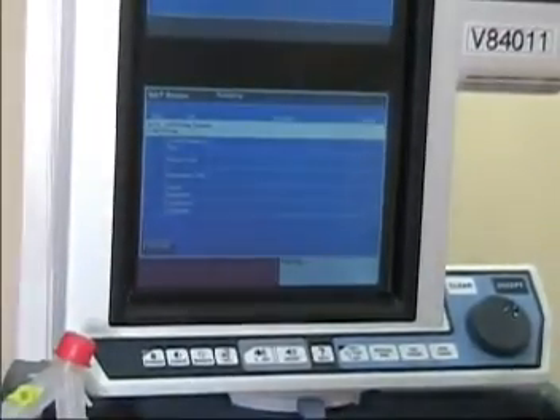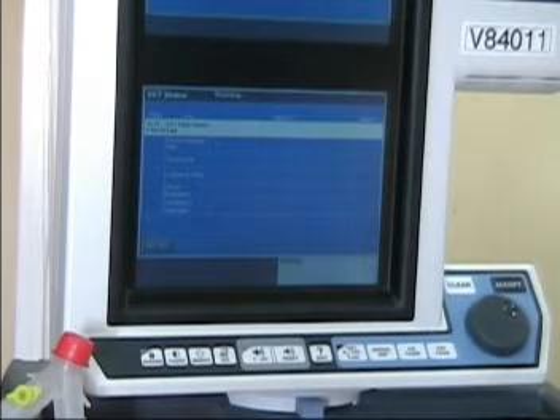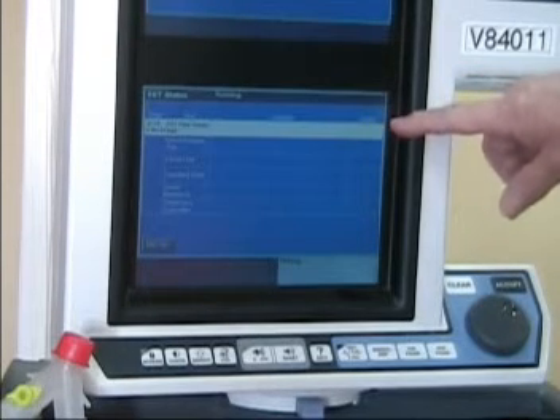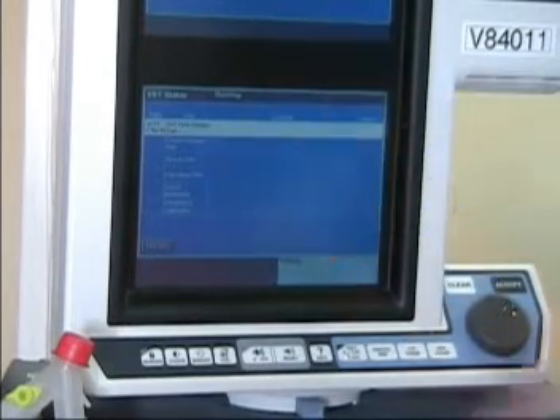The machine is going to automatically test the system and will walk through each step of the self-test. These are normal pressure sounds and flow sounds as the machine goes through the testing. As it goes through each of these various stages, you'll notice it will say 'accepted' or 'not passed.'